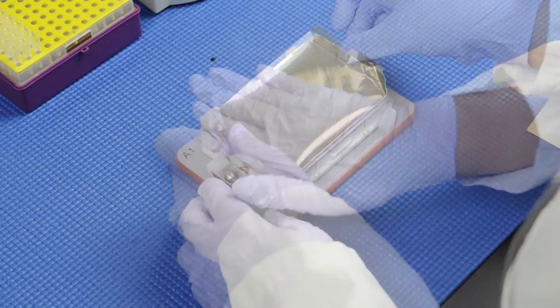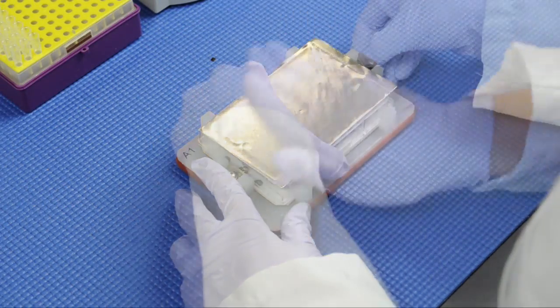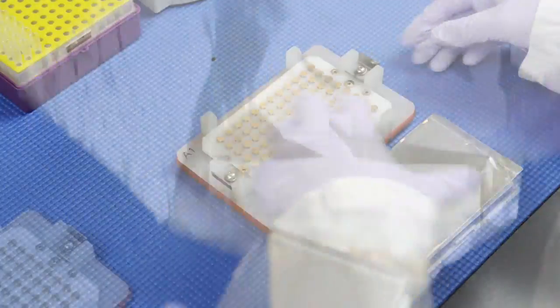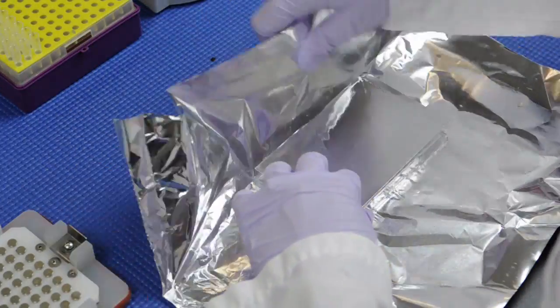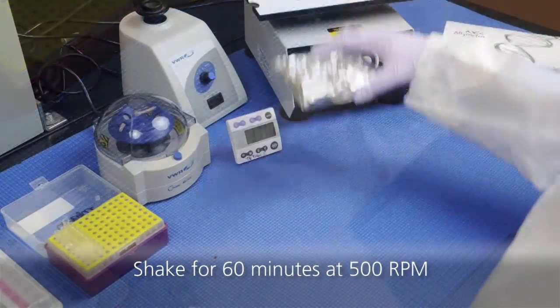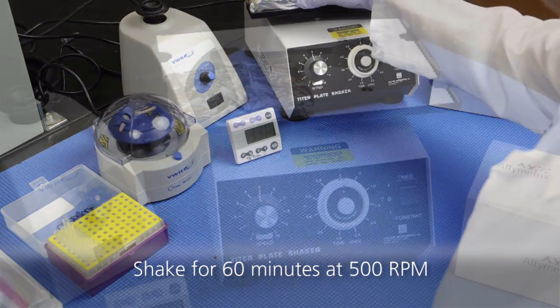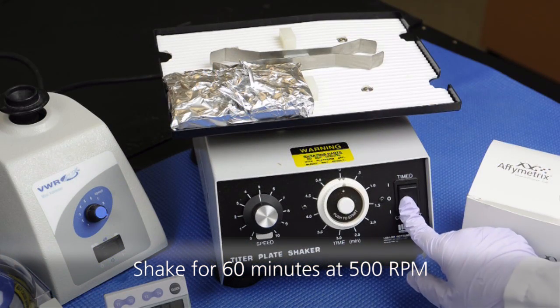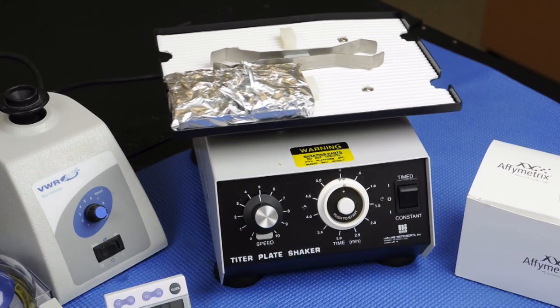Once the samples are loaded, seal the plate with a plate seal. Because the beads are sensitive to light, wrap the plate in aluminum foil and incubate for 60 minutes at room temperature. Set the microtiter shaker at 500 RPM.